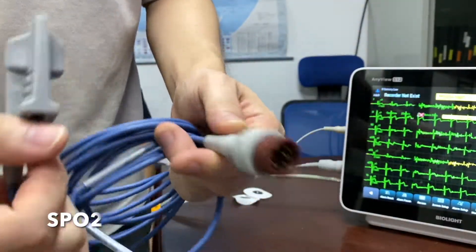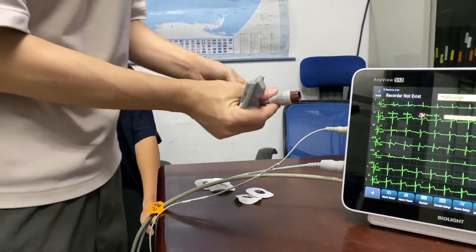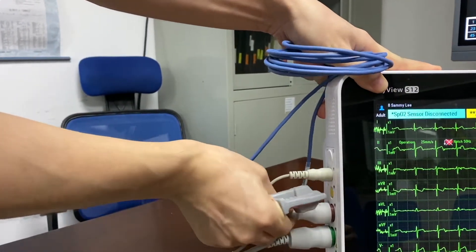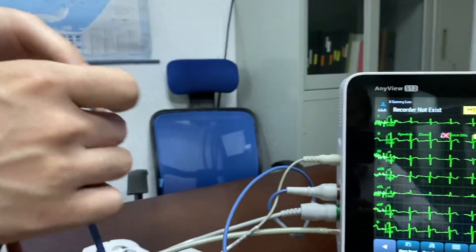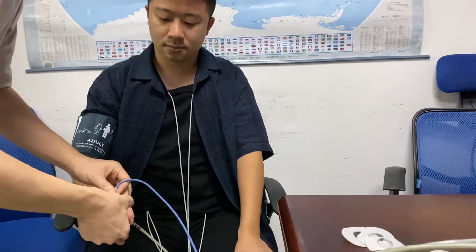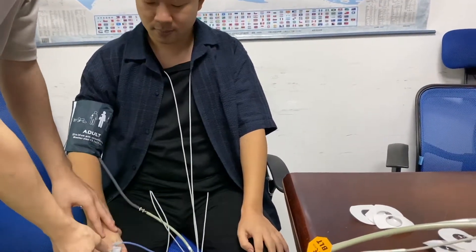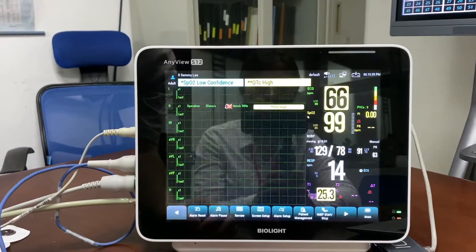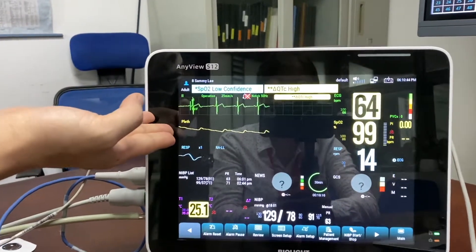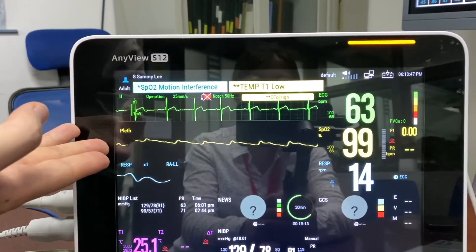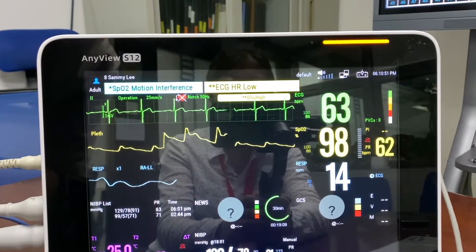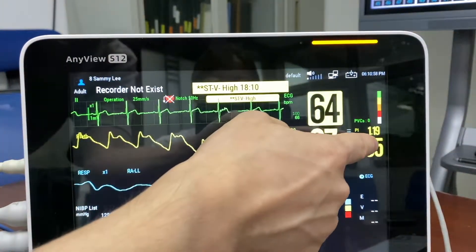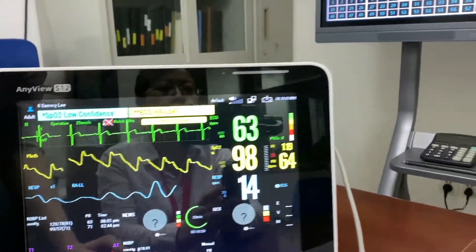This is the SPO2 probe, which is 9-pin, and I'll be connecting it to the S12. Once plugged in, I can put it onto the patient's hand. Once on the patient's hand, I'm able to see the SPO2 readings on the screen. The saturation is 97% right now and I can see the perfusion index as well. On the CMS I'm also able to see the waveforms.